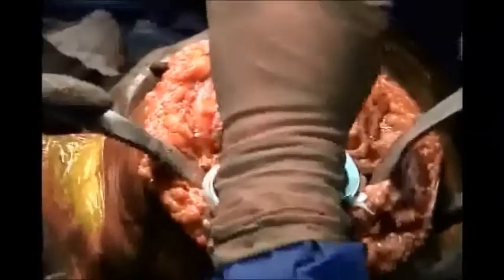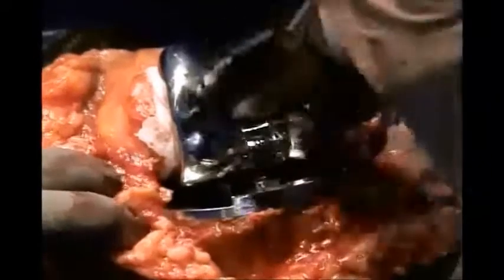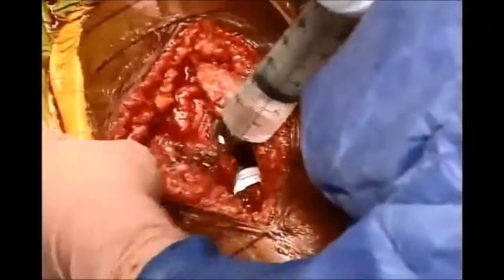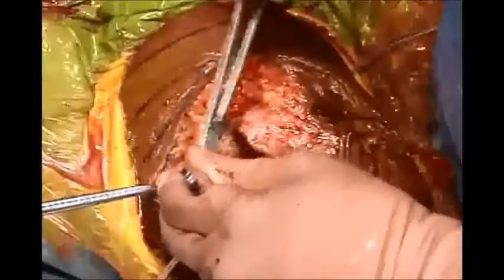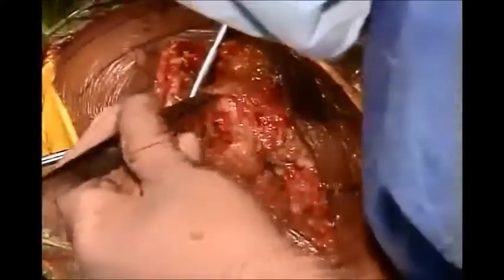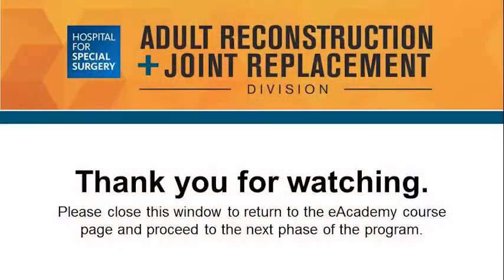For cementation, apply cement on the bone after you clean it with a water lavage — same thing on the femur on both surfaces — and impact it. Then do the patella, extend the knee, and release the tourniquet. So the only part of the operation done under tourniquet is cementation.